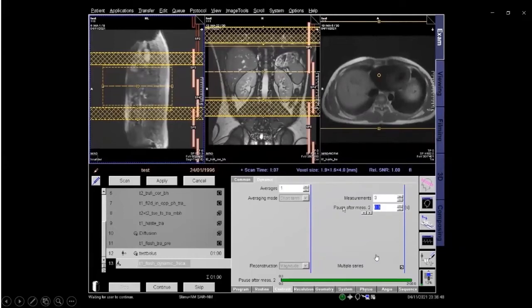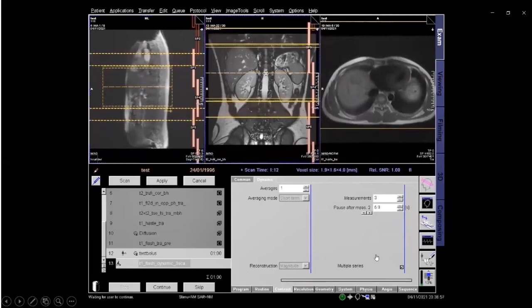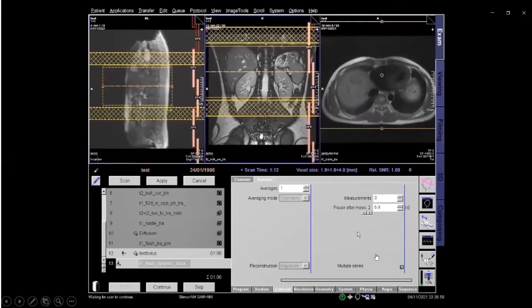But if you're making it 5 seconds, there will be an issue. Once the second scan is finished, the patient will get only 5 seconds to take a breath. Then the patient has to hold the breath again. So there's a chance of movement in the next images. So what we can do is increase the timing from 5 to 8 or 10, something like that. Okay, so we'll increase the time to 8 seconds, that will be fine. Okay, 8 seconds, so that is done.